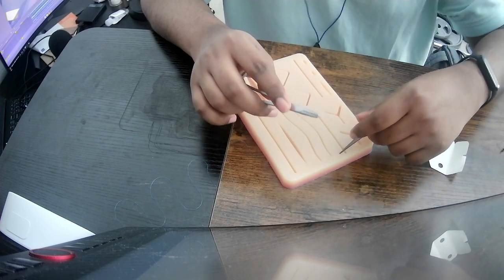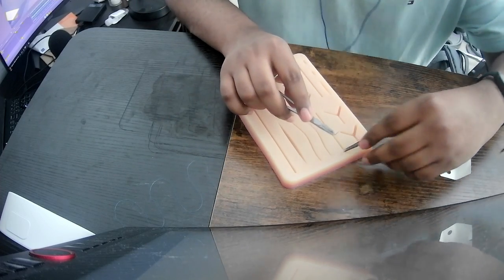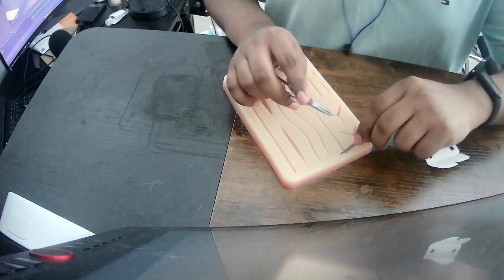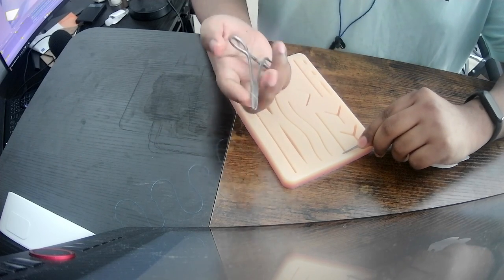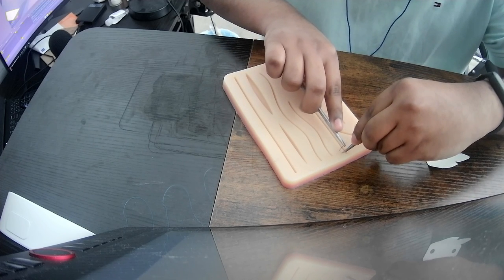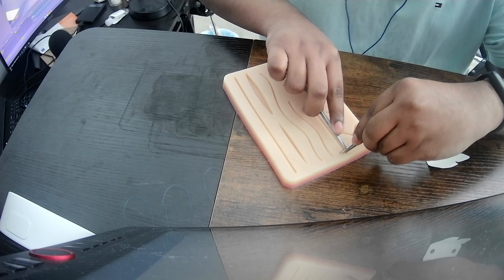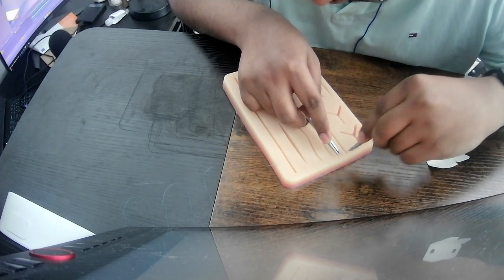Okay, this is exciting. My first time driving the needle, I guess. Oh, right, I've got to be careful of my posture. You're not allowed to be hunched over, apparently. Okay, I have my needle driver. Here we go. I don't know how deep to go. Let me just go pretty deep. Okay. Oh, I see it.